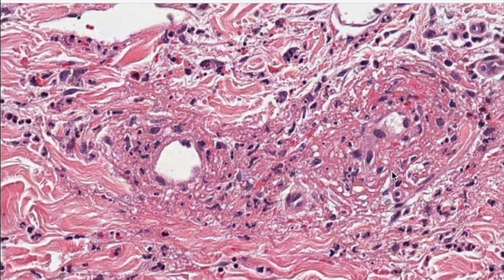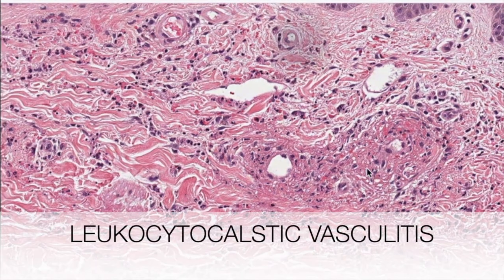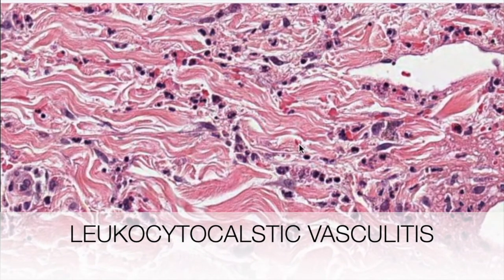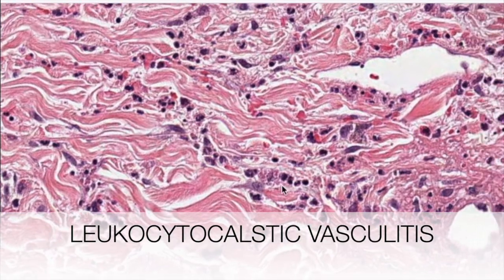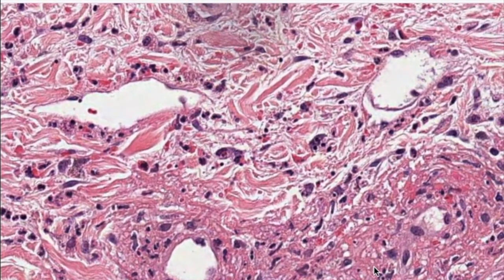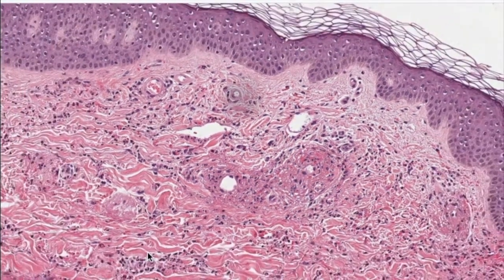So this is LCV, or leukocytoclastic vasculitis. And on high power, you will see all this debris, leukocytoclasis, as they call it. Basically, they are neutrophilic debris.